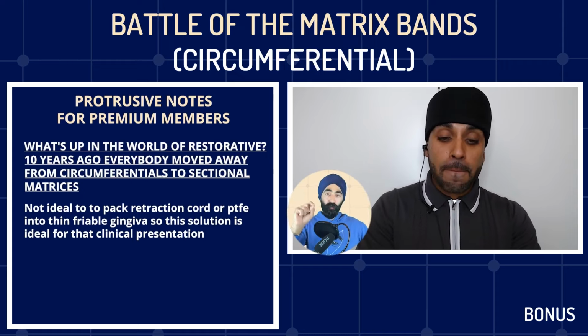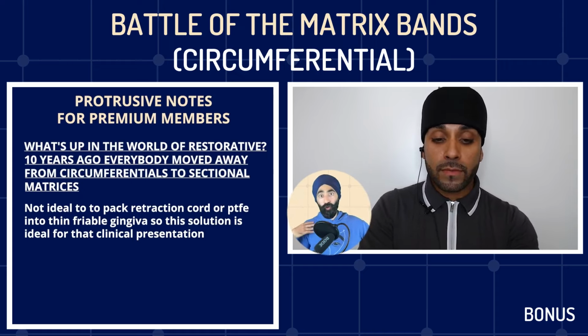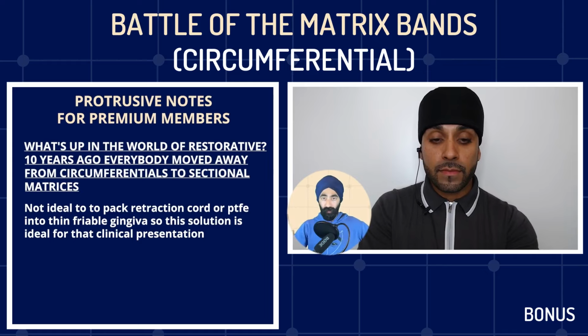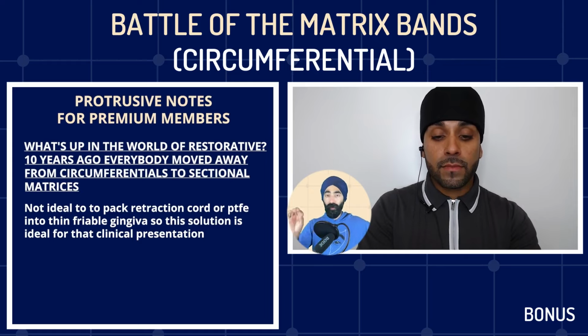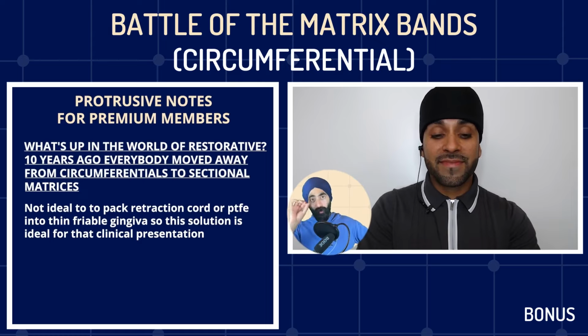No, but you know what? You raise a good point there. My go-to is PTFE for class fives, because it gives the best isolation, but in the correct biotype, a thick biotype. You're totally right there. When you've got a thin biotype, like today, I did a couple on this lady with super, super thin gums. If there was an extra thin biotype, that would be her.